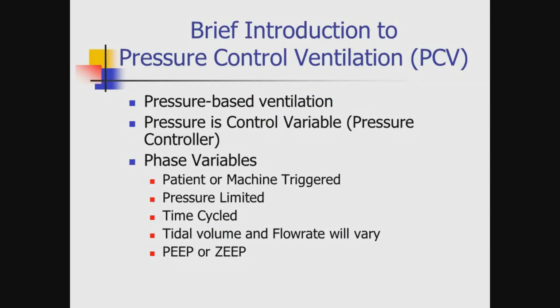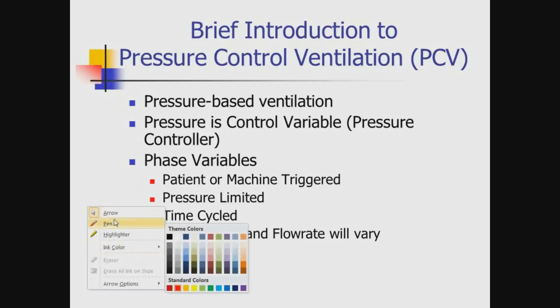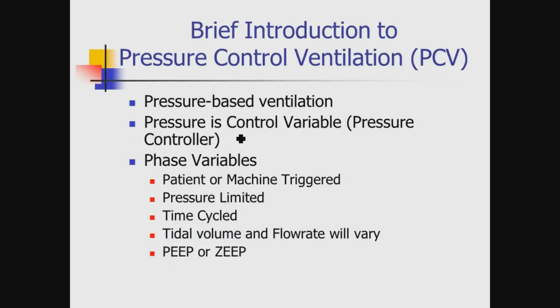All right, pressure control is a mandatory breath that is pressure-oriented. So it is indeed pressure-based ventilation. And as with all pressure-based ventilation, the pressure is the control variable.